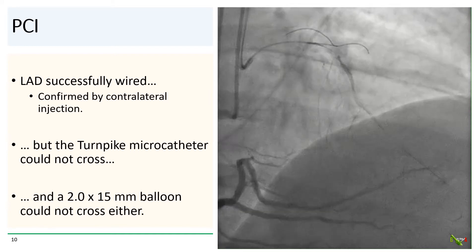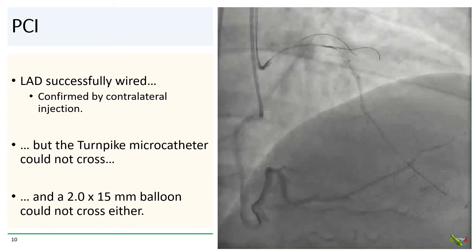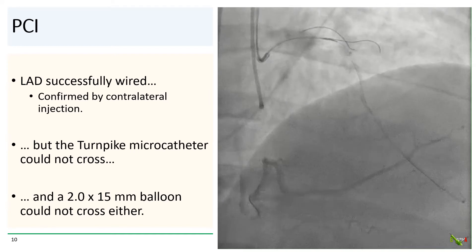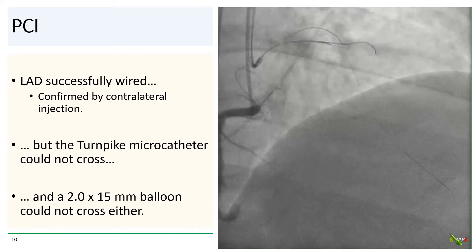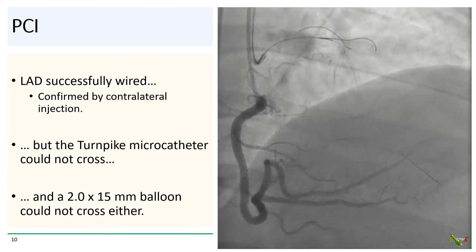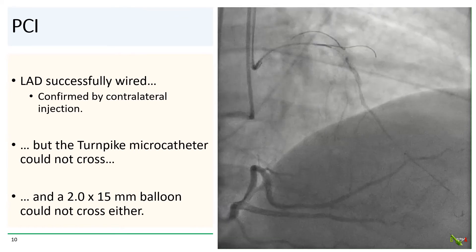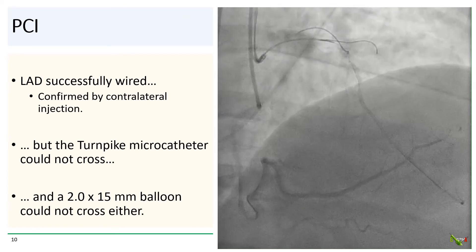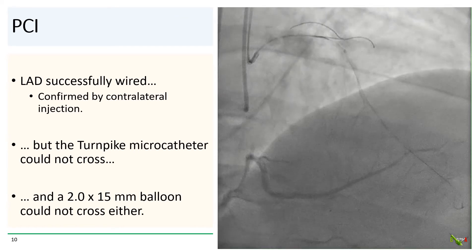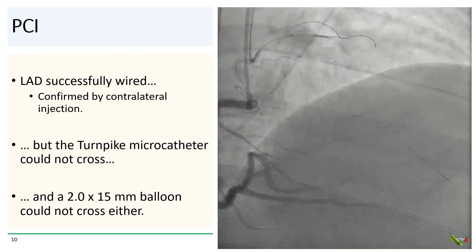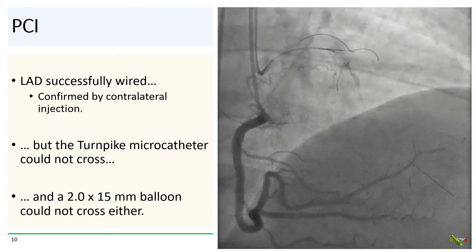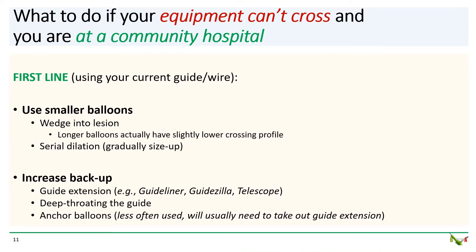After a little effort, the LAD occlusion was successfully crossed. But the turnpike microcatheter could not follow. This is usually not a very good sign. A 2.0 millimeter balloon could not cross either. So what do you do if your wire crosses but your equipment cannot cross and you are at a community hospital?